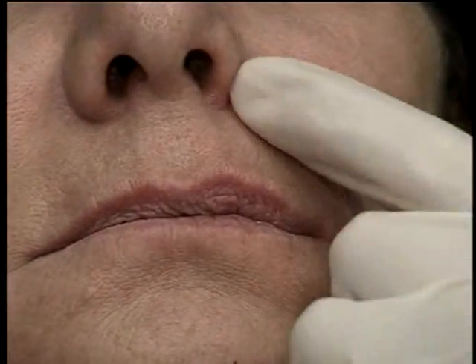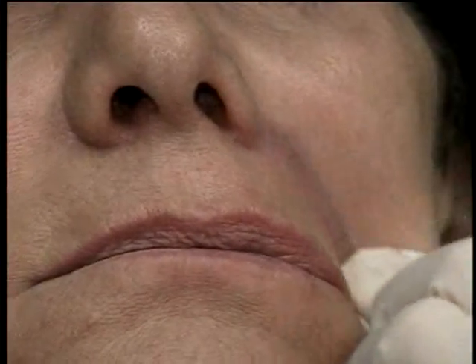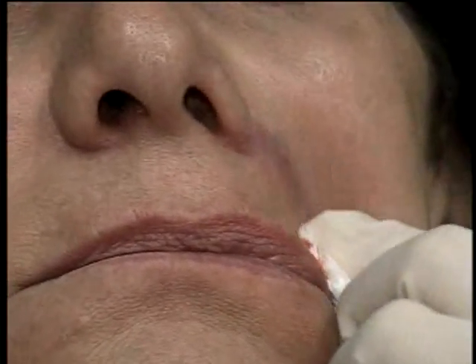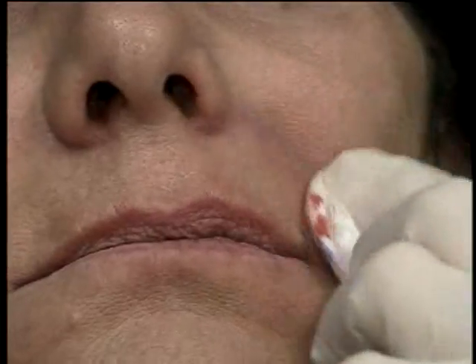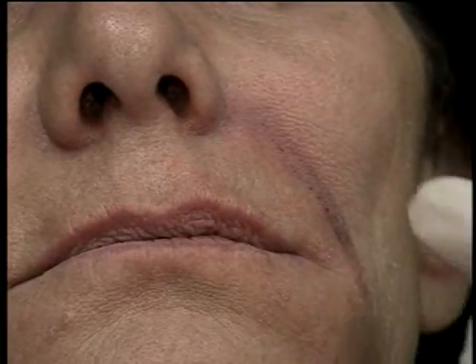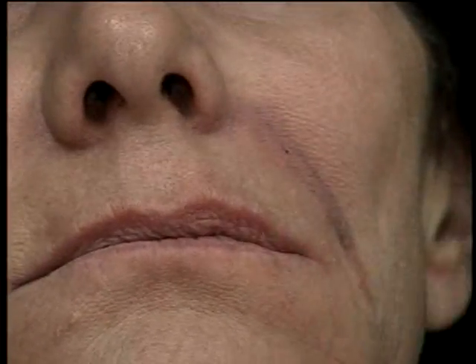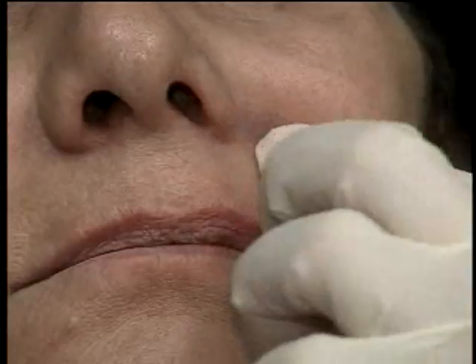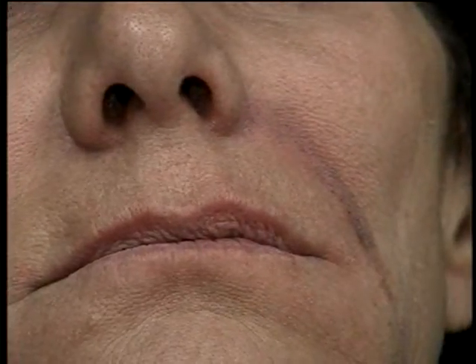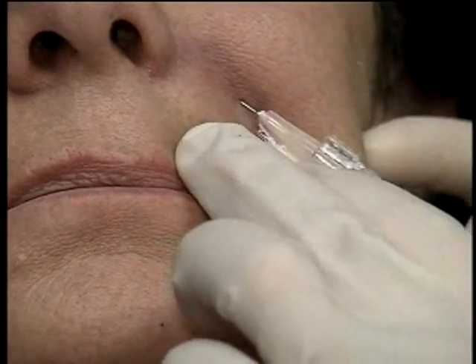And right away you can see that's filled in pretty nicely. And this is immediate correction. Now, I do tell them they may get a little bruised or a little swollen over the first 24 to 48 hours, but it's usually not that bad. I would say about 5% of my patients get bruising that is of concern. Majority of them do not. I think using the slow technique and this fanning technique works quite well. I like to treat to complete correction. I think it gets me the best result.